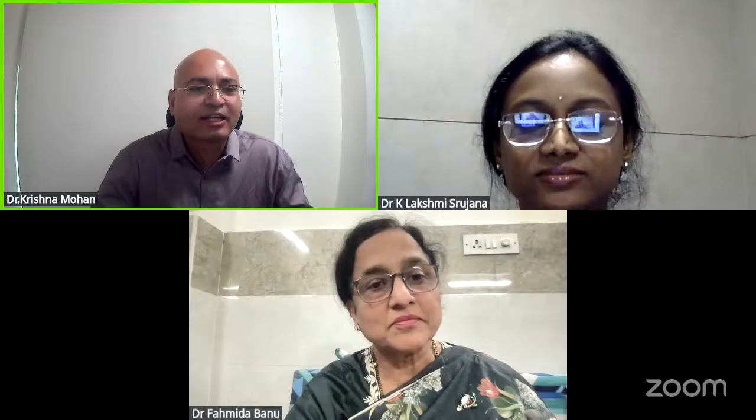Okay. Thank you, madam. Thank you so much for all your inputs. So, that's Dr. Srujana, Dr. Fahmida Banu, madam. So, the final take is like imaging is very crucial for early and non-invasive diagnosis of endometriosis, and it is very valuable in suspected deep infiltrating endometriosis. That's what I think we came to conclusion. To the moderator, because we know moderator is very knowledgeable, can you add a few things for the sake of my postgraduates? Elastography role in endometriosis. Yes, madam.